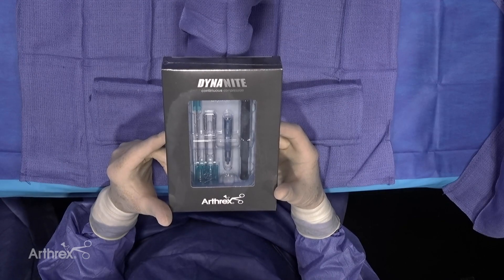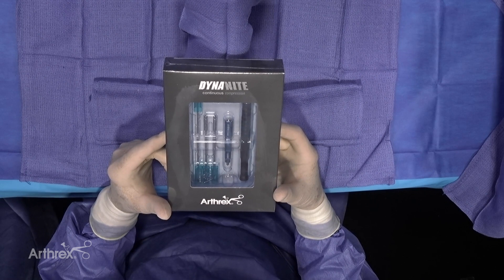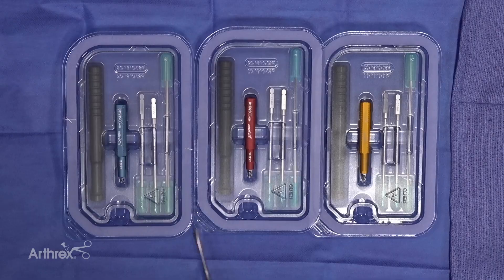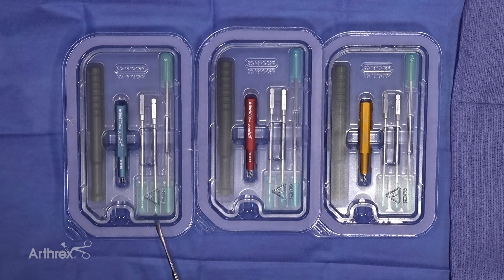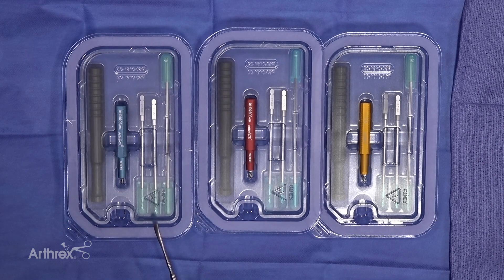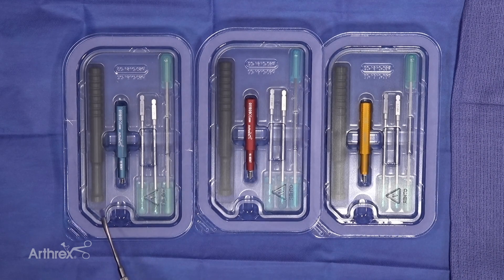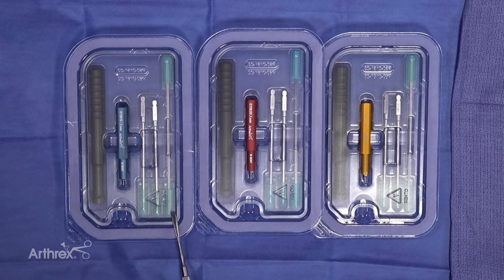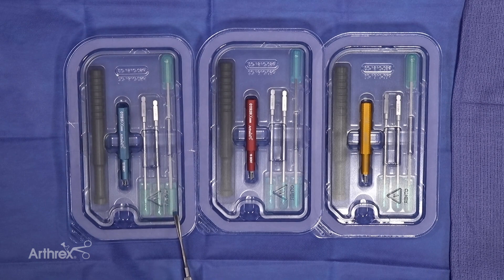This is a Dynanite hammer toe device — a disposable kit that includes the impactor, the drills, and the implant itself. The kit comes in 12, 14, and 16mm sizes, each with its own color coding. You can choose either a straight implant or a bent implant to give a little flexion to the hammer toe. The kit also includes a K-wire, which is a very important part of the cannulated drill set.